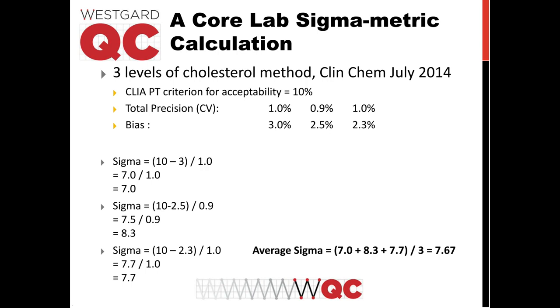You might have a different situation. You might find at the low end you have a lower sigma, and the middle of your range, the mid control, has got a higher sigma, and at the upper end you have a much higher sigma. So you'll have different sigmas being measured at different levels of the test. And this can cause some confusion, it might cause some anxiety. What do you do when you see you have different sigmas at different levels?